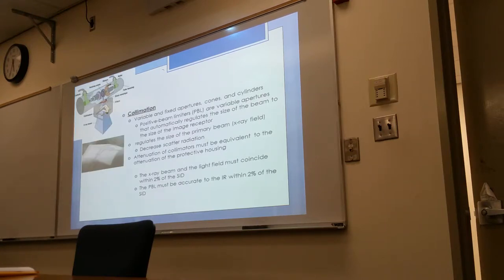Collimation. What do we know about collimation? What is it that we're trying to control with collimation? The beam size? Okay, we're controlling the size of the X-ray beam.